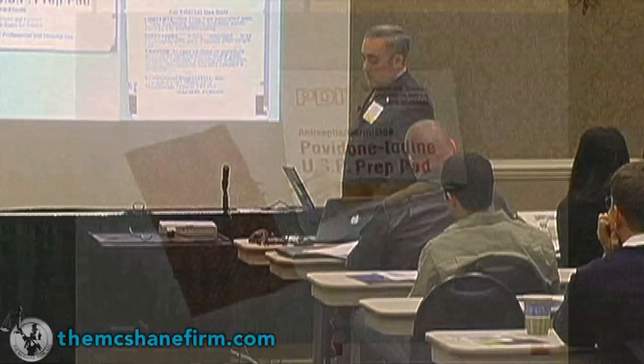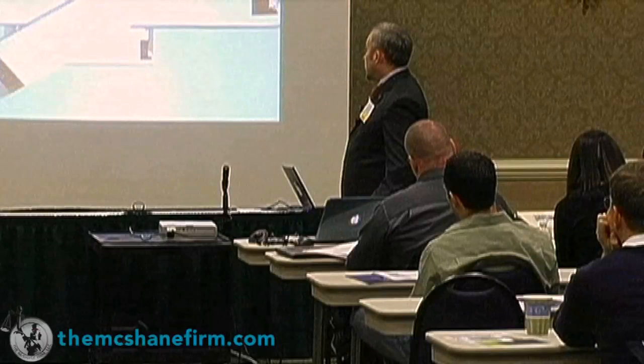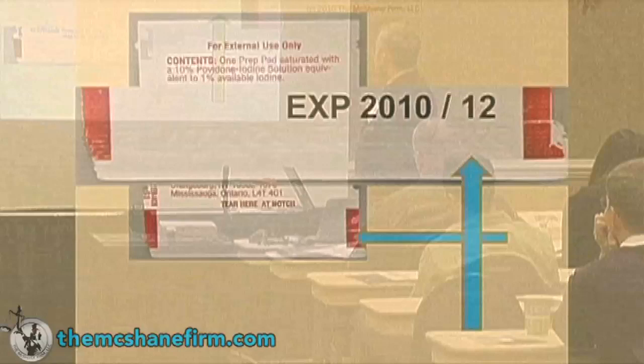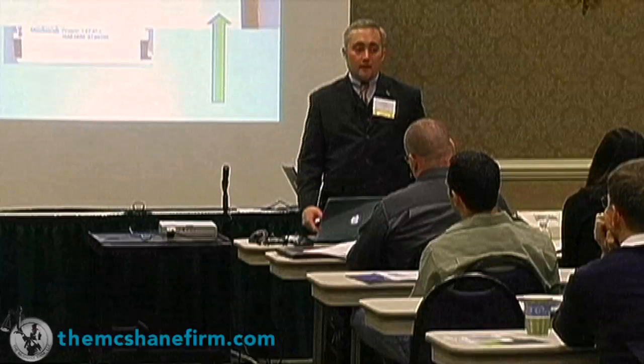Everything on the planet Earth has an expiration date. And the important thing is the povidone iodine, the non-alcoholic swab, even has an expiration. You just have to know where to look for it. It's at the bottom here, and it's embossed. You have to turn it around and take a look at it. That's where it says the expiration date. That means it's good through 12/31/2010. You don't drink milk that's past its expiration. You don't serve it to your kids, and you don't want your phlebotomist using things that are beyond expiration at all.